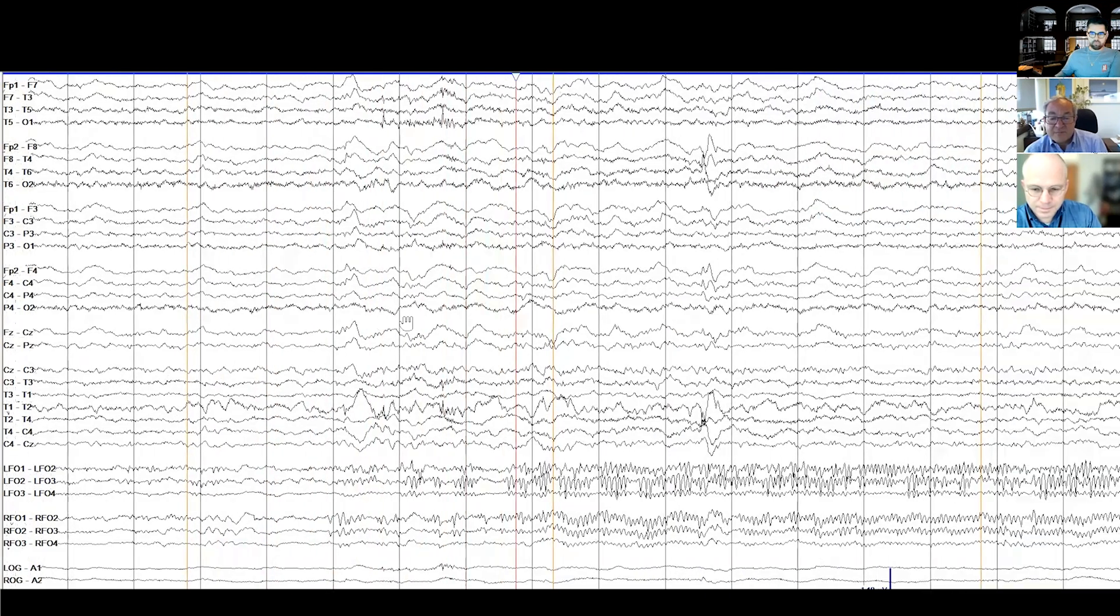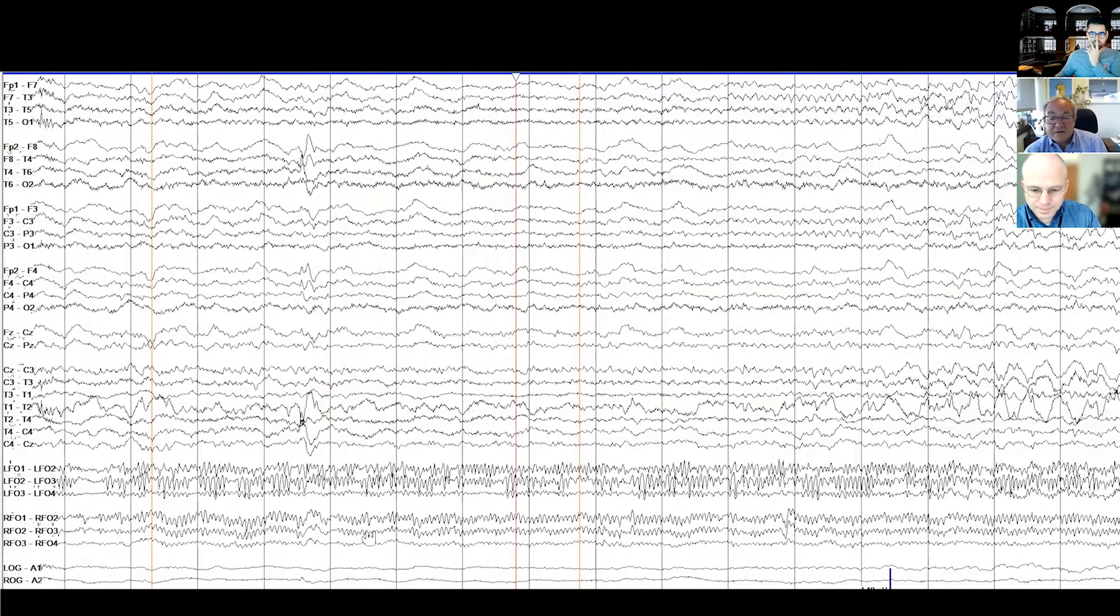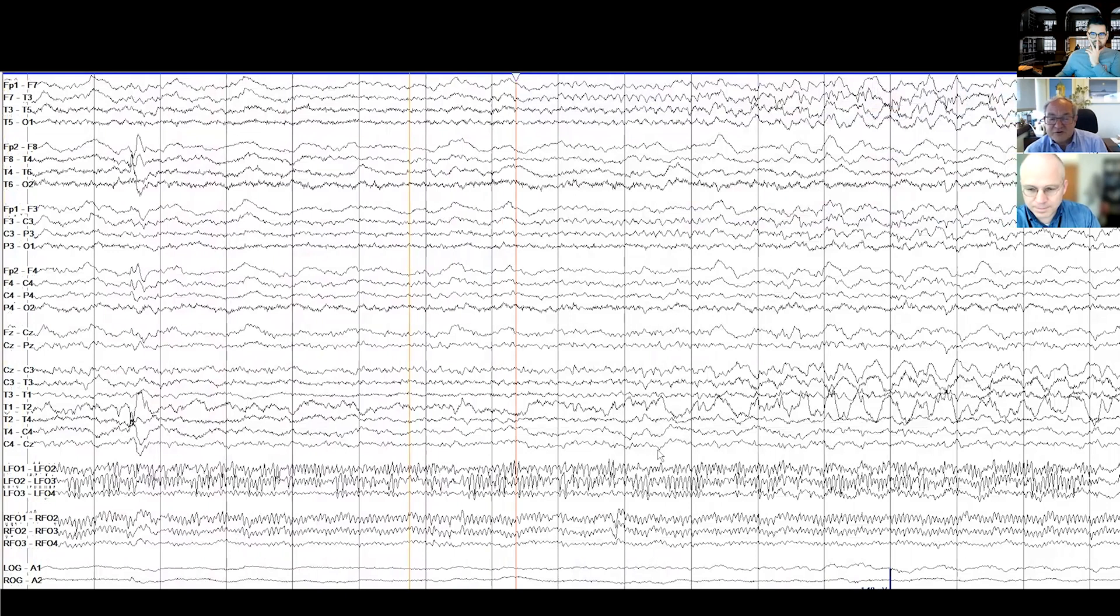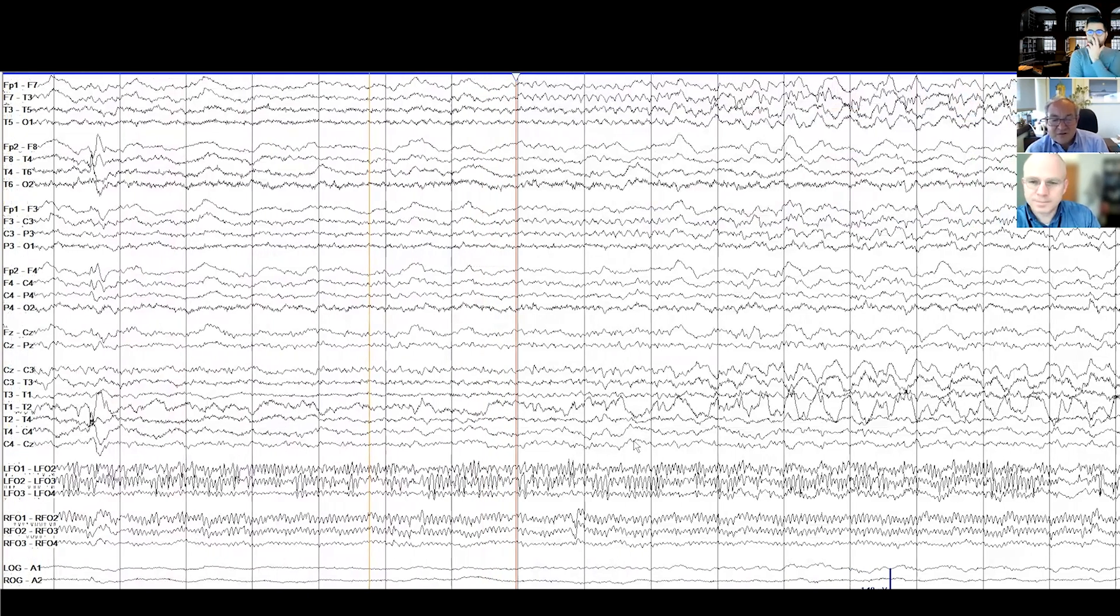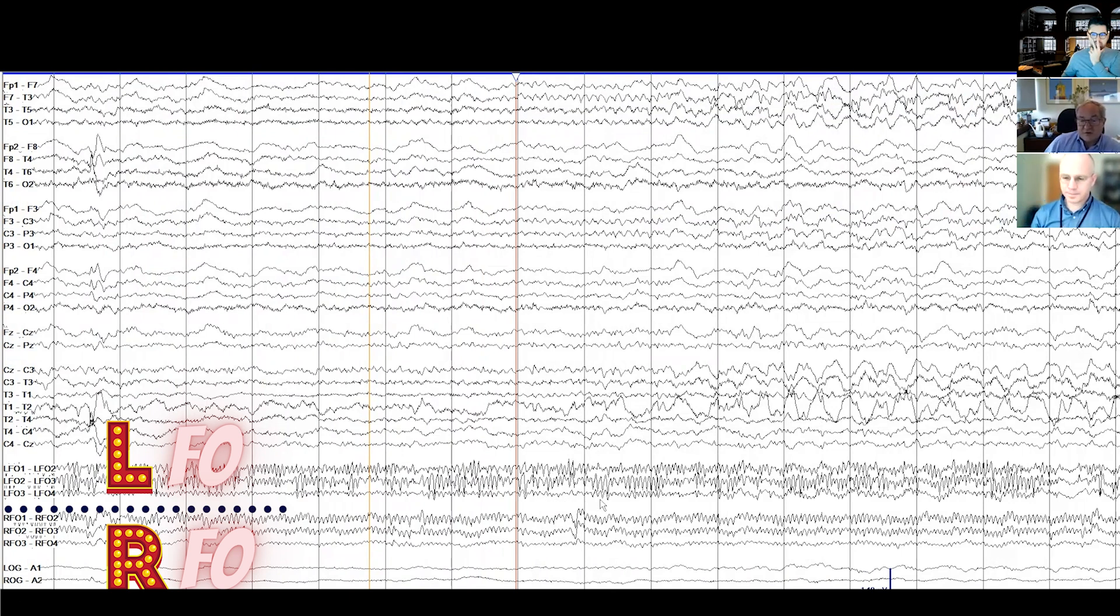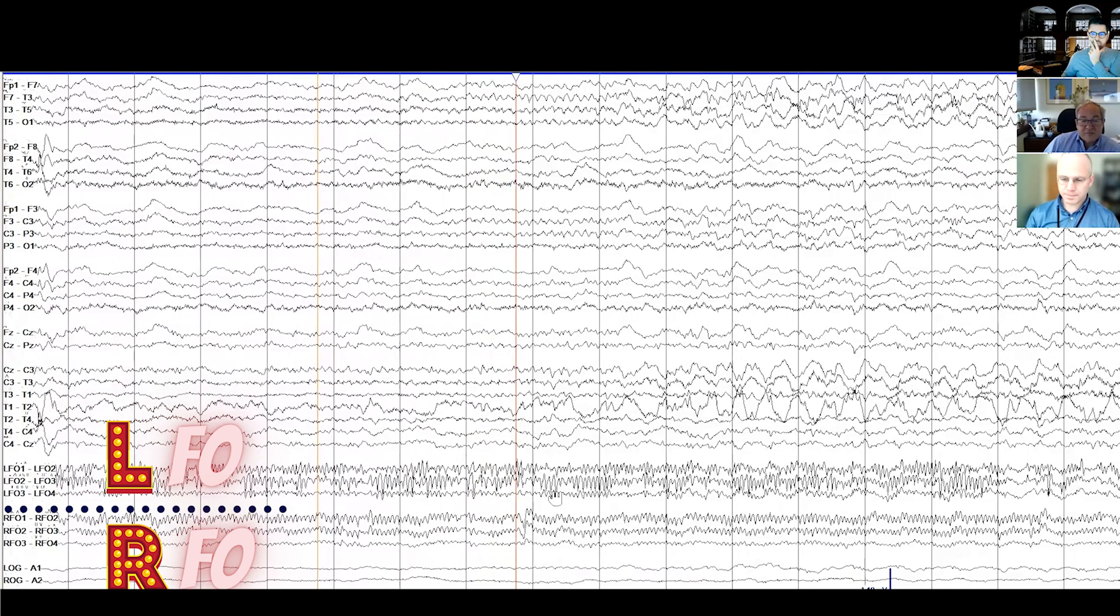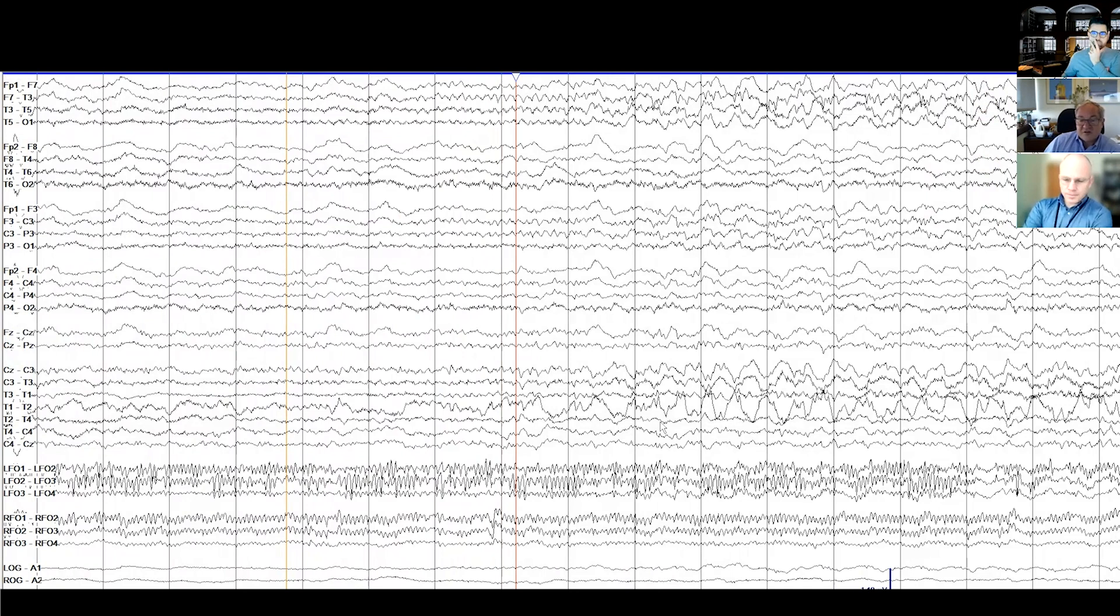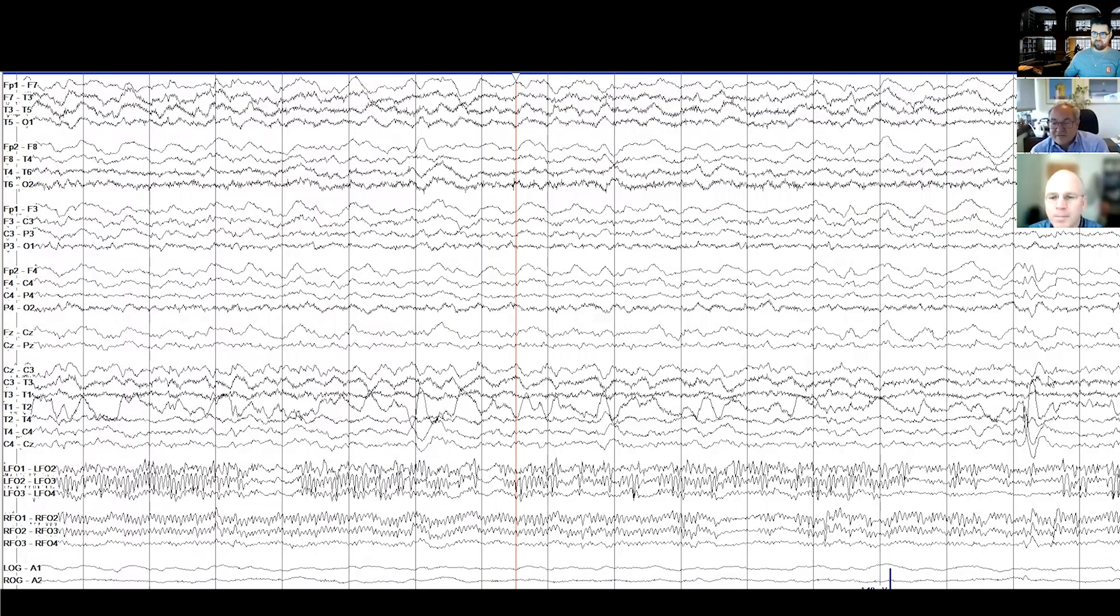Take a look at the overlying coronal ring. Keep going, keep going. There we go. Now look at that. The point of me showing you this: you know what's going on down in the foramen ovale electrodes down here at the bottom of the page. I'm not sure what that is that we've been seeing all along in this guy's recording, these bursts like this. But now we see what appears to be an ictal pattern coming from the scalp, suggesting that maybe some of the seizures don't actually start in the mesial structures. They start laterally in the neocortex. Look at that big right-sided spike right at the end, a neocortical spike, not a foramen ovale spike.